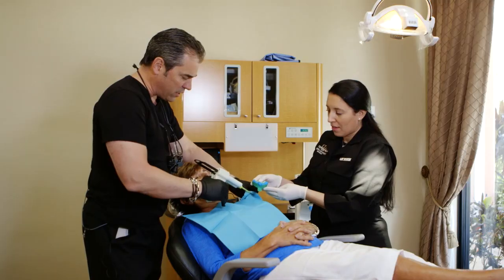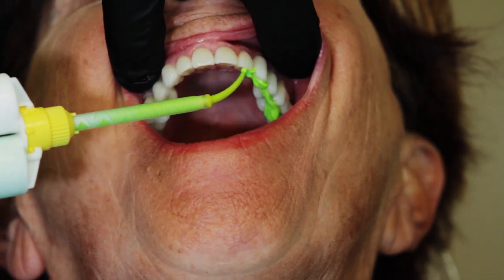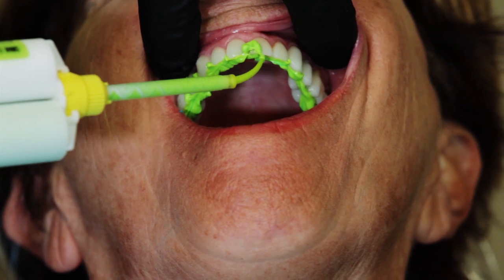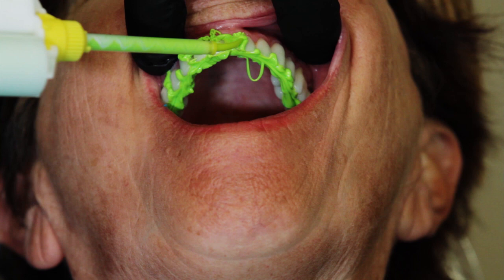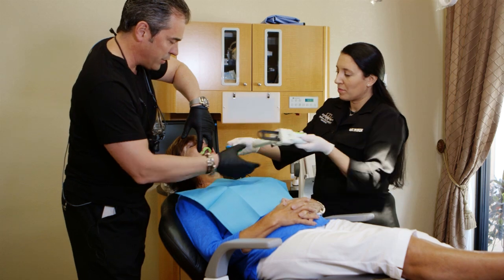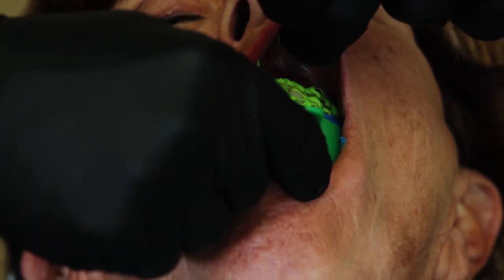Now we're all set to go into the mouth. Chin up for me there. As I mentioned earlier, I am really big about the use of wash material all over the occlusal table. So although I may be focusing on one prepared tooth, I really am a big advocate for the use of a lot of wash, as we see here. What we have here now, all over the margins, my belief is you can never use too much wash. So here we have lots of wash material, and now simply the wash that's in the mouth and the wash that's in the tray has a nice ability to combine where we won't see a lot of voids.